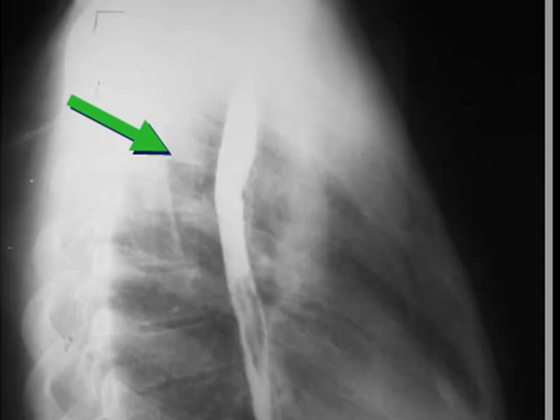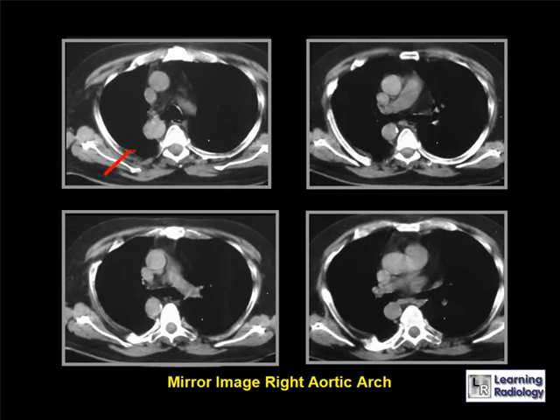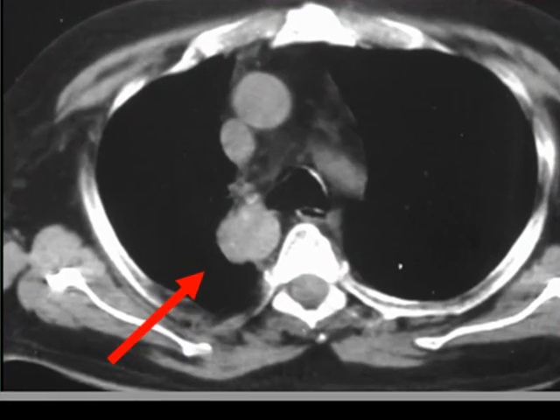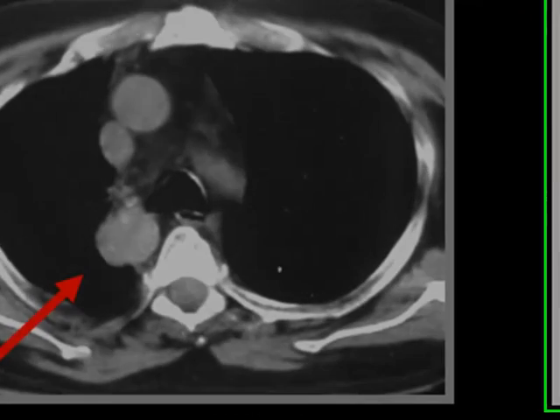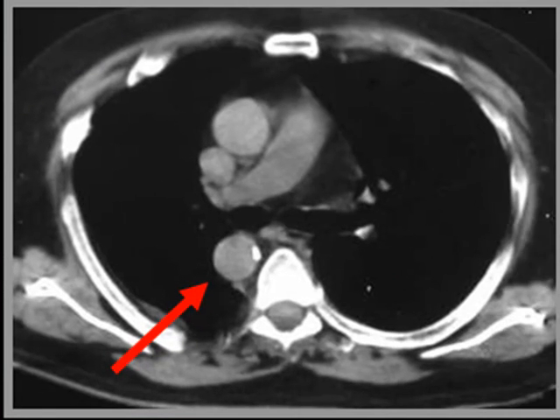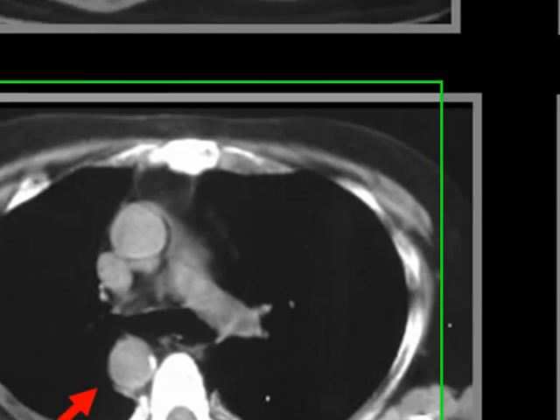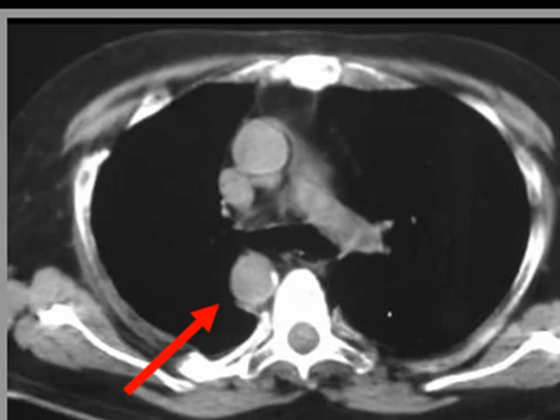On the lateral view, the green arrow demonstrates that there is no forward displacement of either the barium-filled esophagus or air in the trachea. Here is a series of CT images in another patient with a mirror image right aortic arch. You can see that the aortic arch is on the right side and that there is no vessel that passes posterior to the air in the trachea or the esophagus.